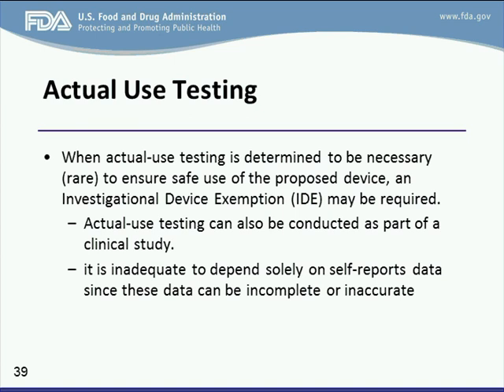So there are cases where the simulated use testing might not be sufficient. As an example, for a certain type of home use dialysis system, certain human factors issues can only be validated in the actual use environment. So for that case, you need to consider conducting human factors testing in an actual use environment.